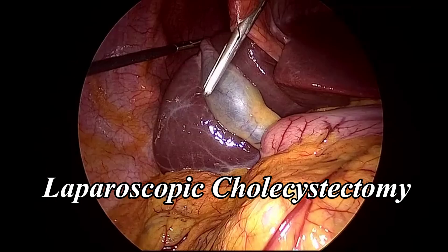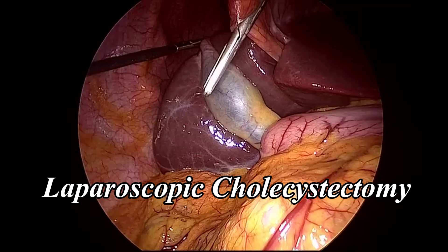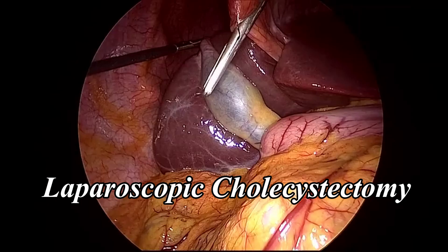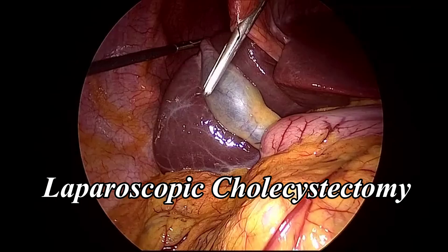Step 4: Dissection of Calot's Triangle. Using blunt and electrocautery dissection, the peritoneum overlying Calot's triangle is incised. Dissection continues until the cystic duct and cystic artery are clearly isolated. Only these two structures should enter the gallbladder — this is known as the critical view of safety. The cystic artery is clipped proximally and distally with laparoscopic clip appliers, then divided with scissors. The same is done for the cystic duct. Pitfall: failure to obtain the critical view is the number one cause of major bile duct injury. Take your time.